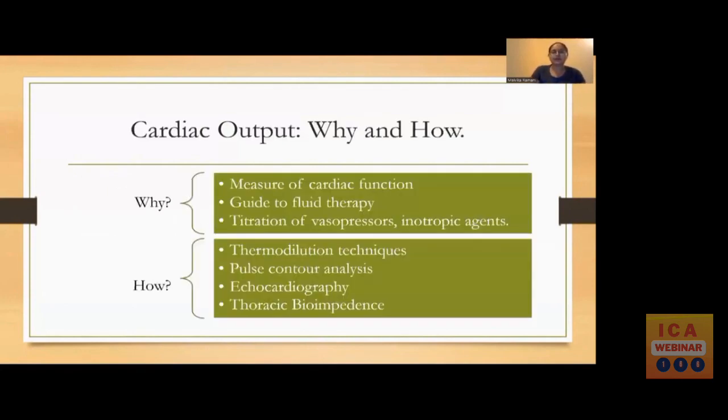So cardiac output, why do we really have to measure it and how do we measure it? Cardiac output is a measure of cardiac function. It can be a guide to fluid therapy, and it will help titrate the vasopressors and inotropic agents as per the needs of the patient, which can be done in various setups, whether it be cardiac or non-cardiac surgery.